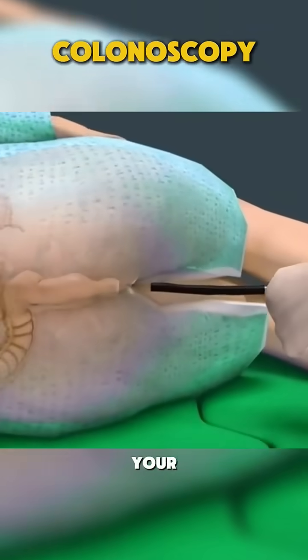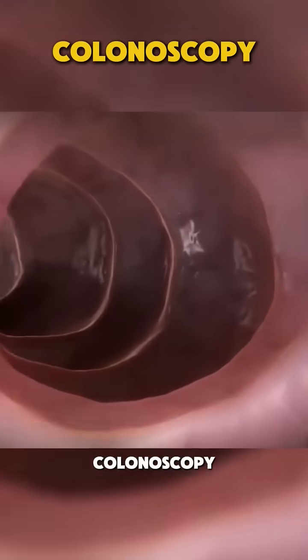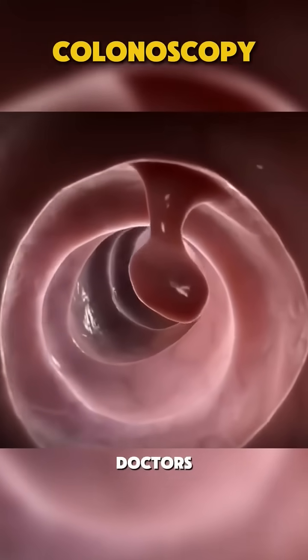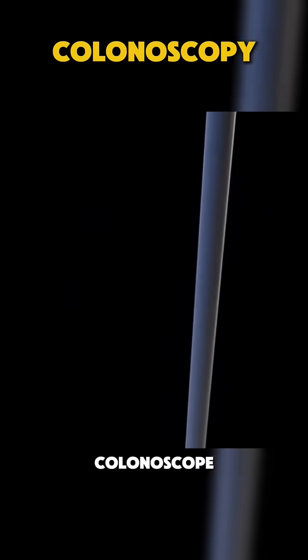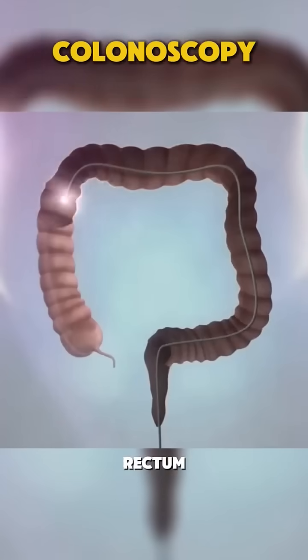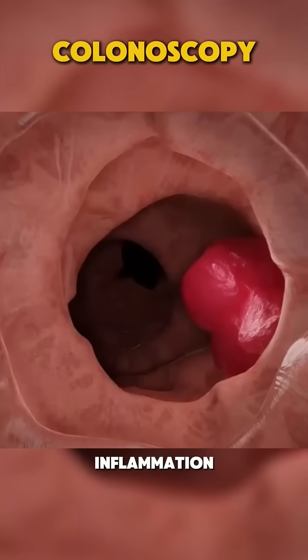Ever wondered how doctors check inside your colon? Let's take a look at how colonoscopy is performed. A colonoscopy is a procedure where doctors use a flexible tube with a tiny camera called a colonoscope to examine the lining of your colon and rectum. This helps detect conditions like polyps, cancer, or inflammation.